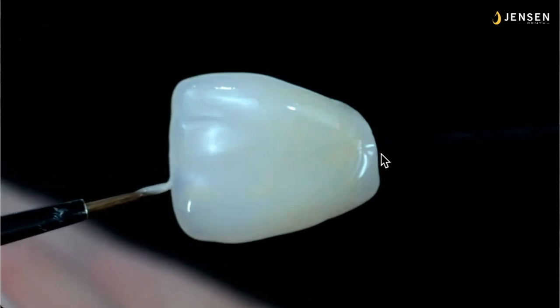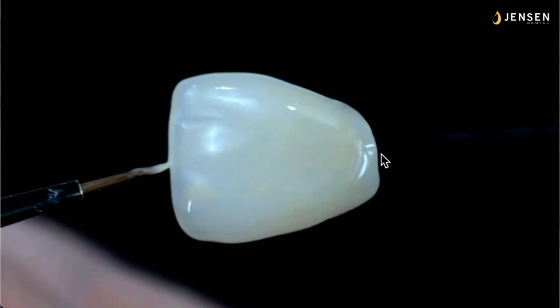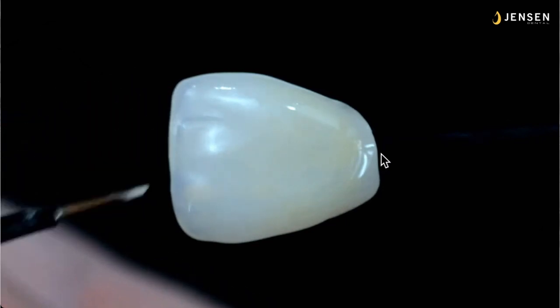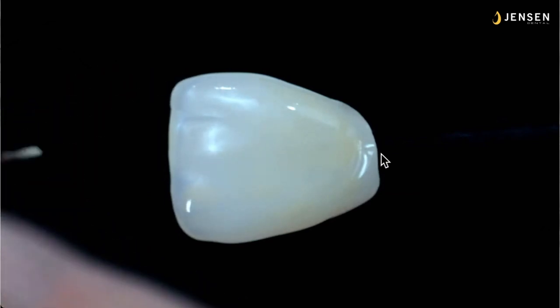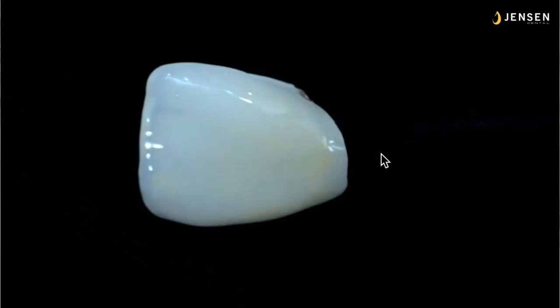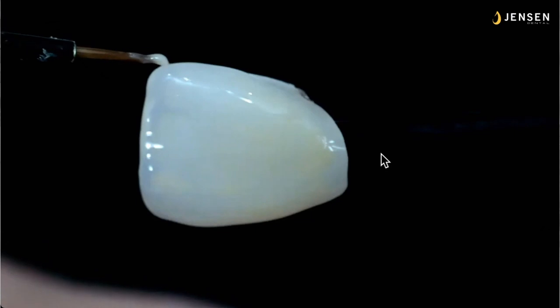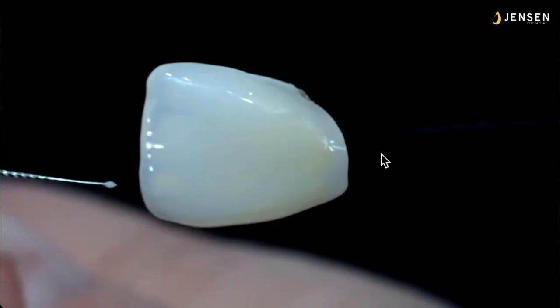The main thing to remember is do not be heavy-handed. Just let this material slide off the brush. It's like a fountain pen. Not like a ballpoint, but more like a fountain pen. So you just let the color touch the paste glaze, and it wants to slide off. And that's why you don't want the color in the bristles. So if you find the colors wanting to stick to the brush and not slide off, clean your brush in water, wipe it on a tissue, and get a little bit of glaze liquid in it, and it'll slide right off.